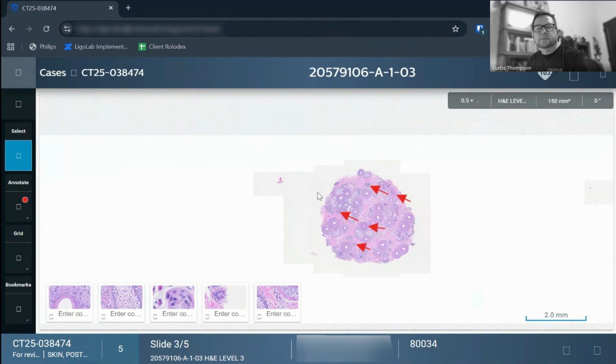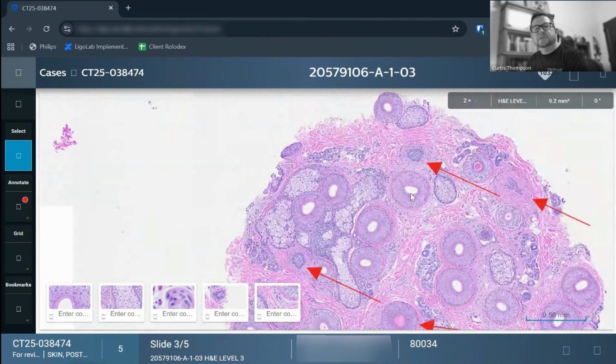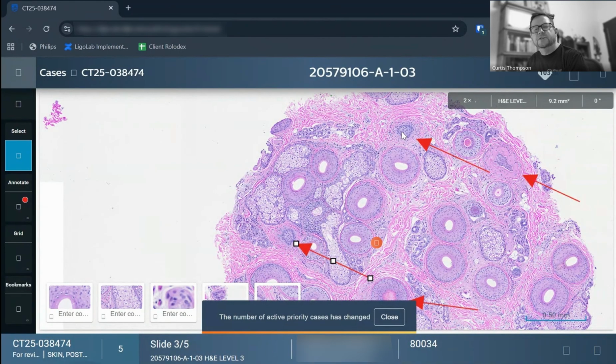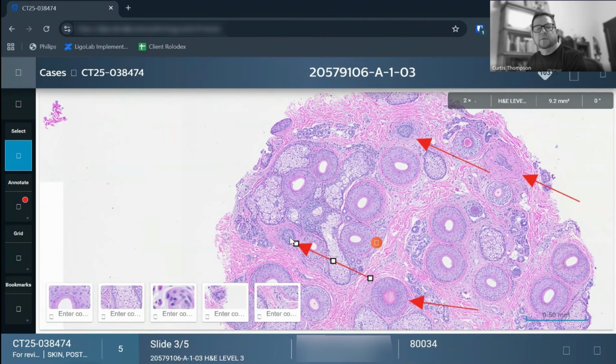And then you can see up a little higher, and this is a teaching point for skin pathologists, that in these cases you'll see a lot of these catagen, telogen phase follicles. So this is what they look like when you're shedding a hair. All our hairs are cycling at different times, and then you shed them. And so in androgenetic alopecia, whether it's a man or a woman, you have increased hair loss. And this is especially true when it's androgen driven, like in young men and even in young women.